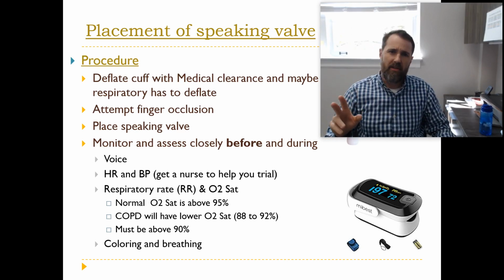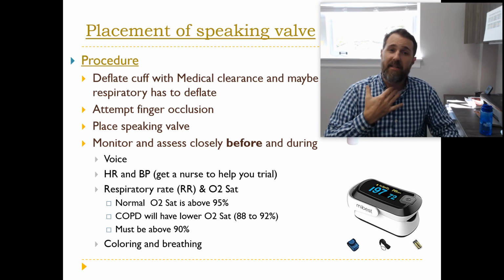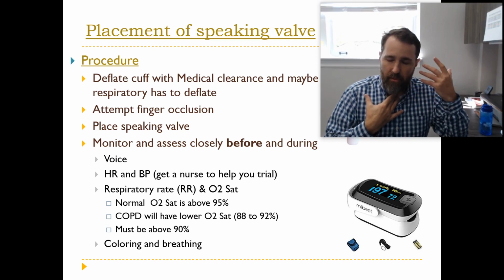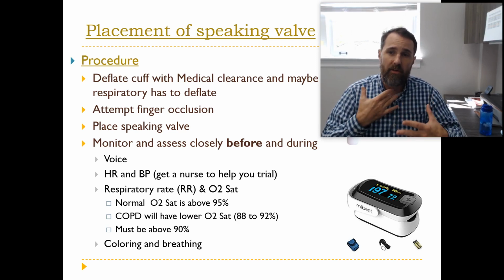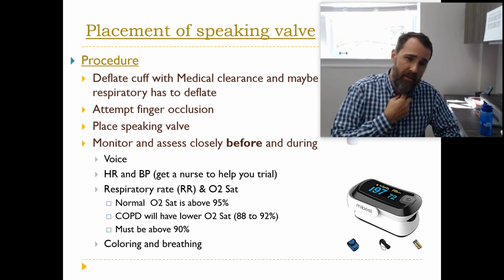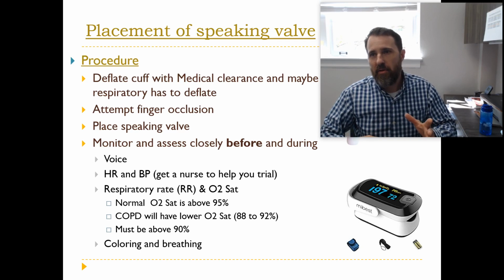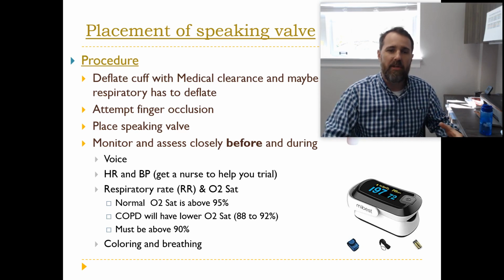So what this process looks like after you have deflated the cuff is that you're probably going to ask them to take a deep breath, and on expiration, start humming. And you're going to occlude the tracheostomy tube, which is going to redirect that airflow through the vocal folds and allow them to hum. And you're going to see how well they tolerate that. And then you're going to increase the finger occlusion from there up to the point where you think they can tolerate the speaking valve. Then you're going to put the speaking valve in place, and they're probably only going to be able to tolerate it for a minute or two. And then you take it off. But then you come back maybe later in the afternoon and you try again. And over a course of days, you increase their tolerance to the speaking valve.